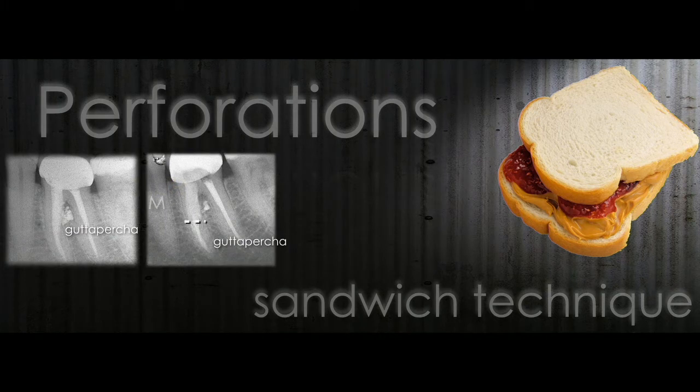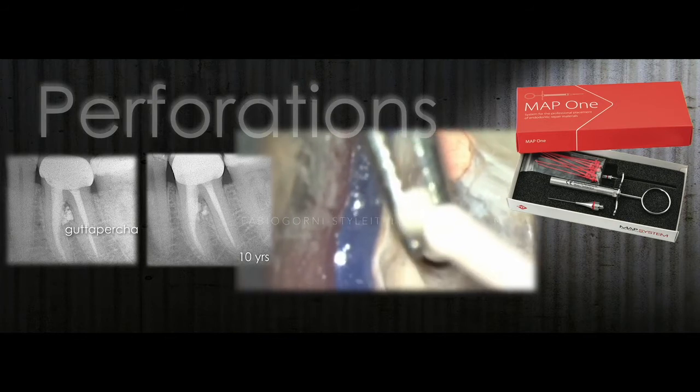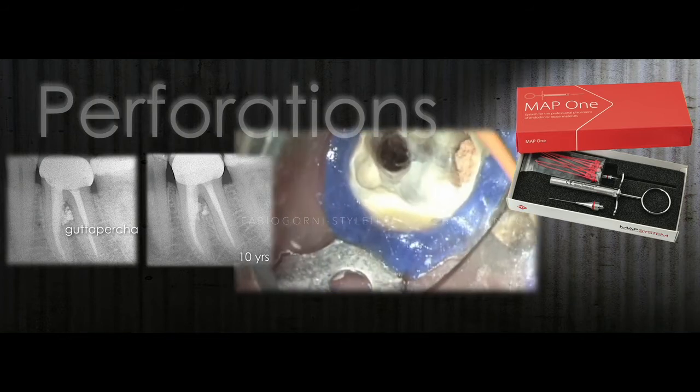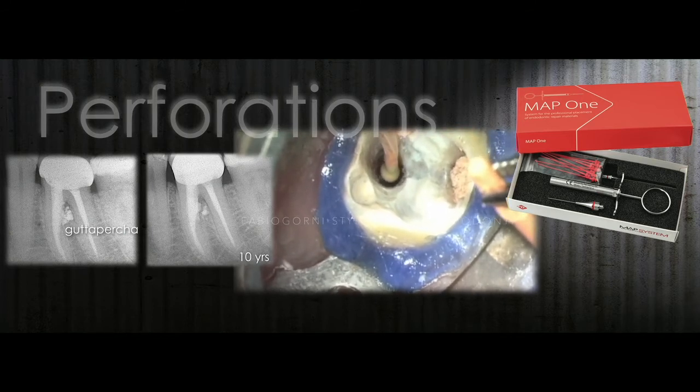When the therapy has been done correctly, we can use the sandwich technique also in a simpler way, because in this case it's enough to remove the gutta percha in the middle 1/3 and substitute it with the MTA. So that's why in cases like this, the therapy is really, really simple. In the video we can follow all the procedure in the lower molar, where we have a perforation or a stripping in the middle 1/3, and now after cleaning and shaping we are packing the apical 1/3.